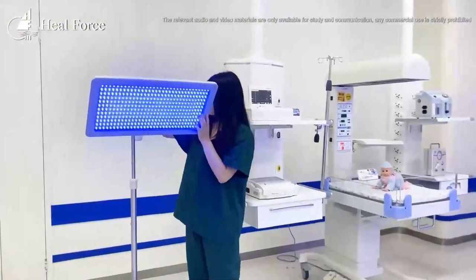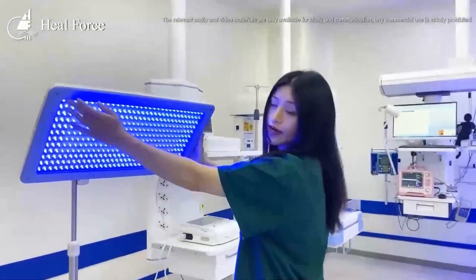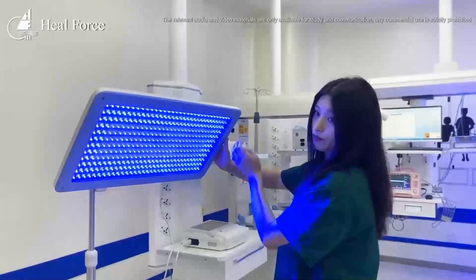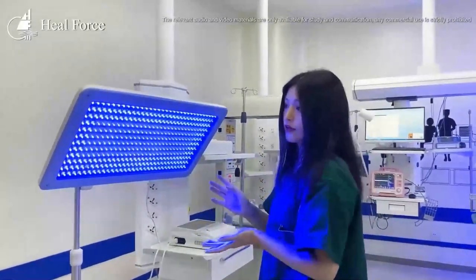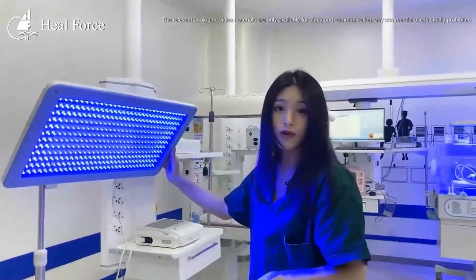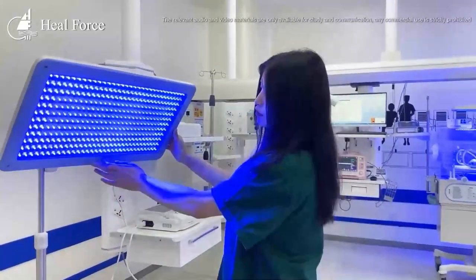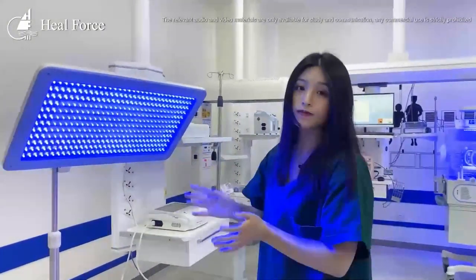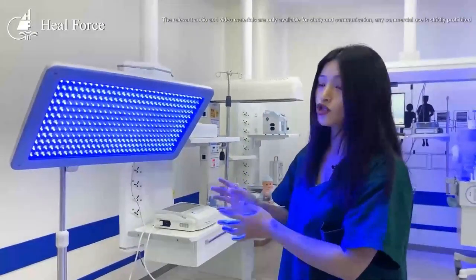We designed over 500 blue light beads. Other companies have several blue light bulbs or blue light tubes, but we designed multiple beads. They are much better, and we can give the baby better jaundice treatment.